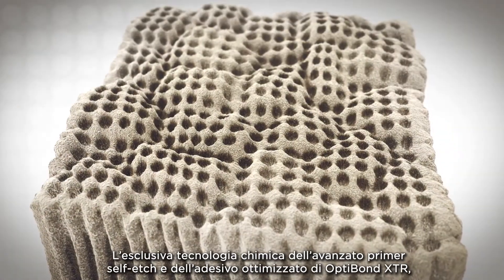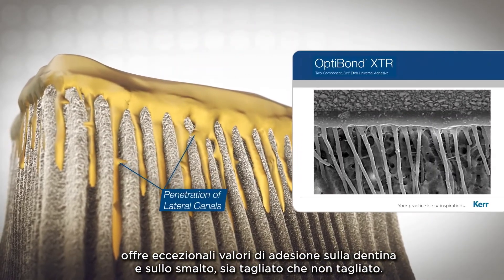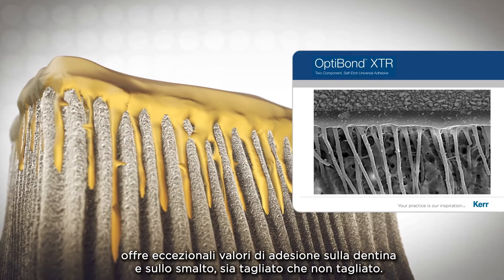The unique chemistry of the enhanced self-etch primer and optimized adhesive in XTR brings outstanding bond strengths to cut and uncut enamel and dentin.